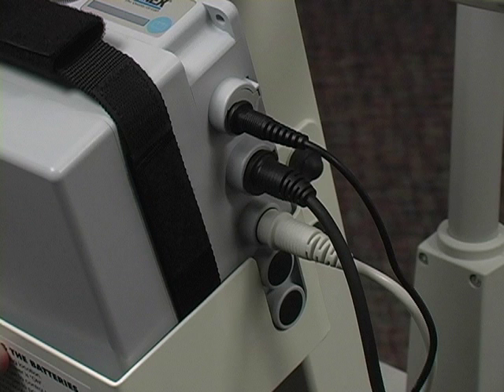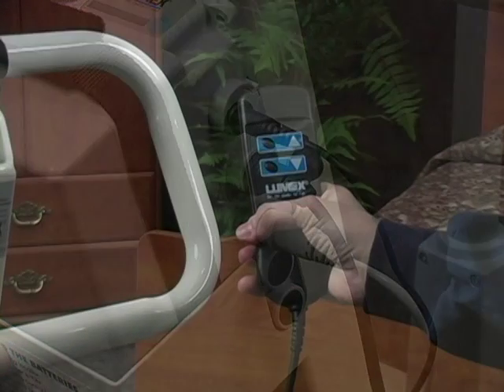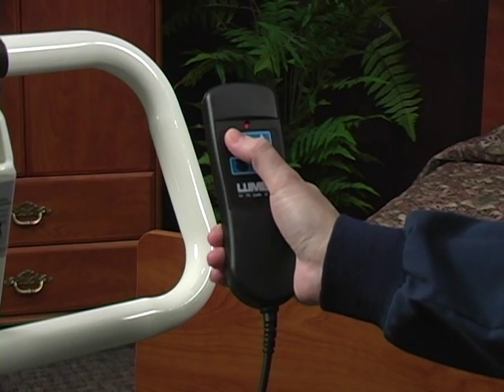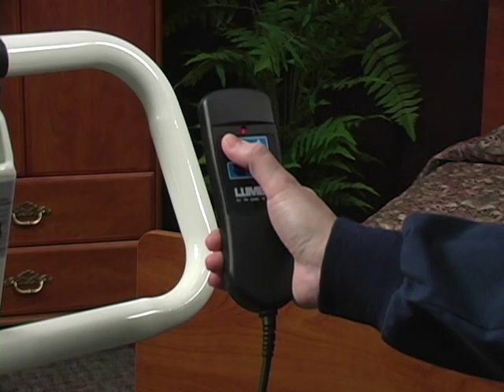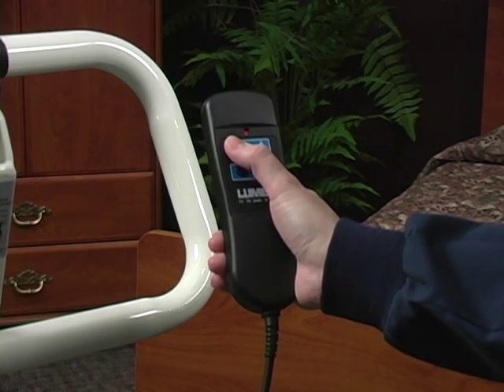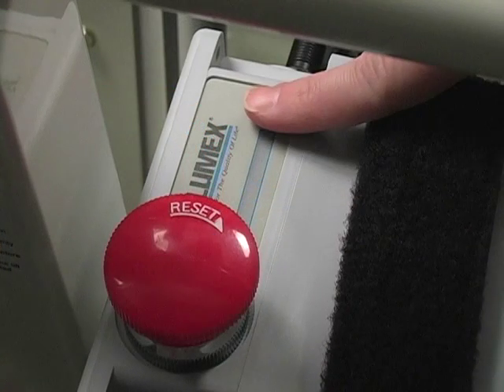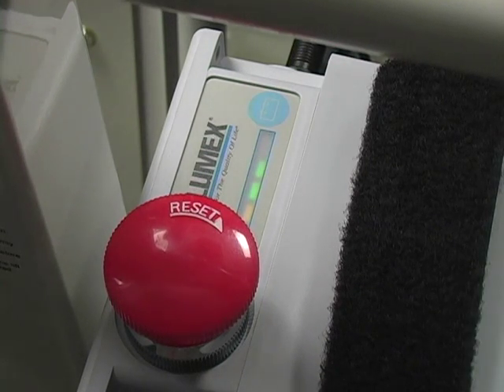Your new lift should be initially charged for 10 to 12 hours. The lift is controlled with a hand pendant, which hooks onto the push bar for easy access. When you hit the up or down arrow on the hand pendant, the remaining charge will be reflected by the three charge indicator lights. Three green lights indicate a full charge. You can also touch the battery testing button on the control box and the remaining charge will be shown.